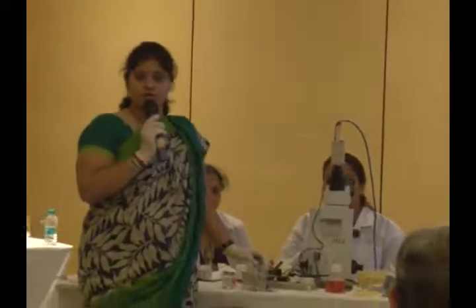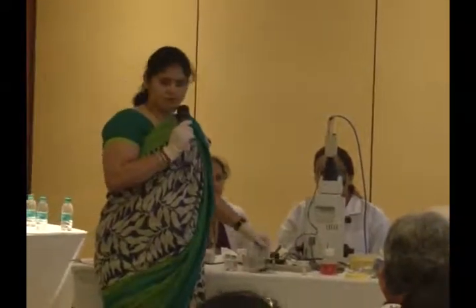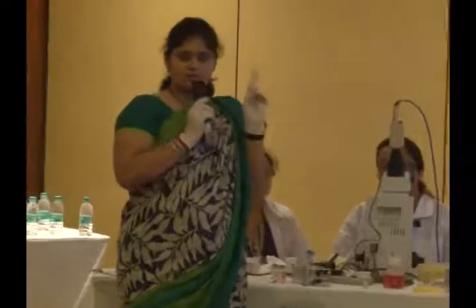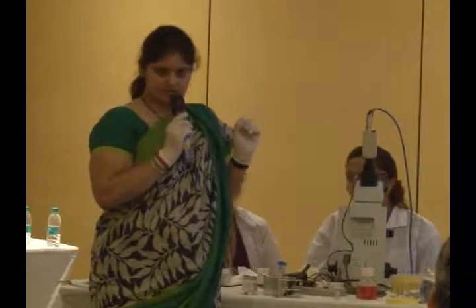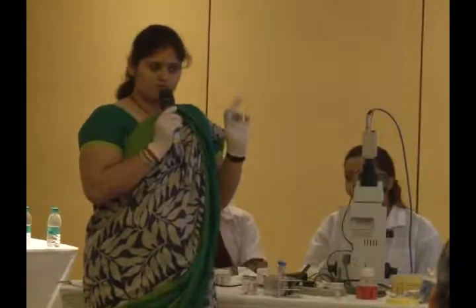Now we have a sample and we have to process it by two methods. One is swim up and one is density gradient. I would like to tell you the labware which we use for the method. One is the round bottom tube. This is for swim up. We always do swim up in a round bottom tube because they have to swim up. For that they require more surface area. That is the reason we use a round bottom tube.